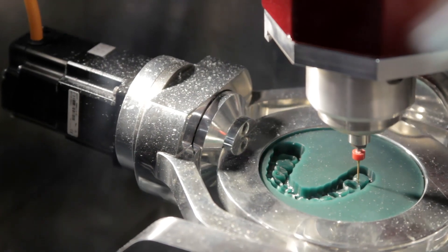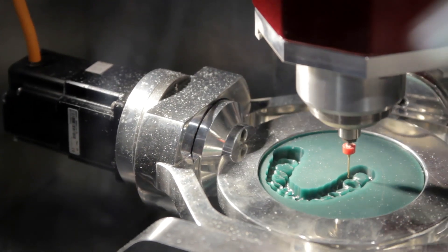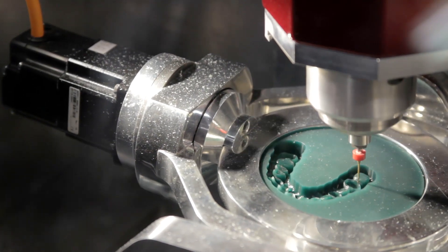On the programming side, we provide the core CNC kernel, which does all the G-code processing for the machine. Around that kernel, the customer builds his interface, which allows him to create an easy-to-use interface for dentists who aren't typically CNC machinists.